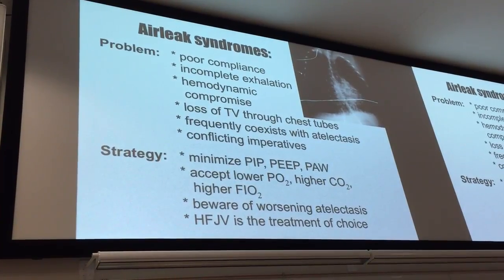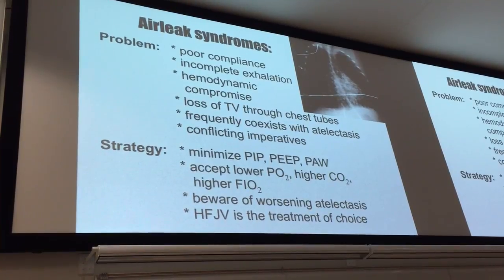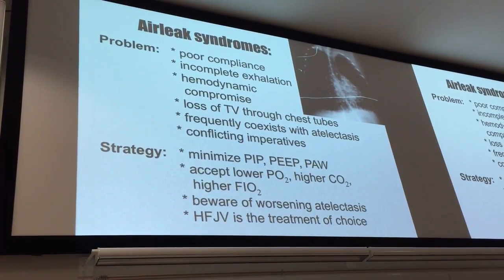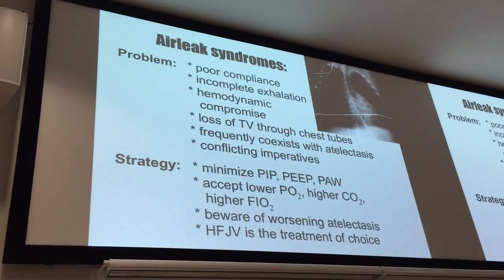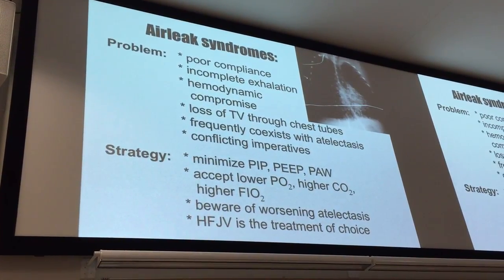So you're on your own whether you use conventional or high frequency. It's not clear which is the better tool. But again, high frequency used well is better than conventional used badly, and the other way around. Conventional ventilation used effectively is going to give you better results than high frequency used the wrong way.